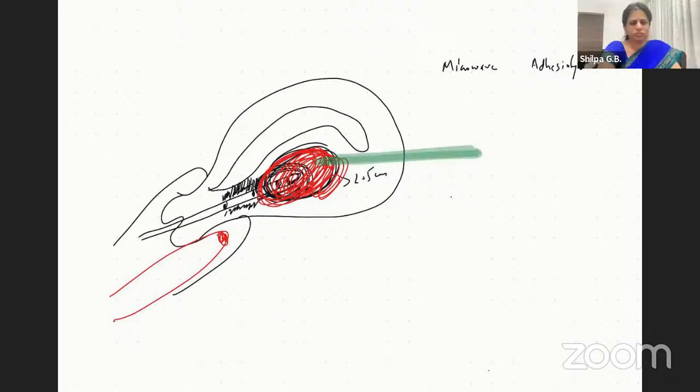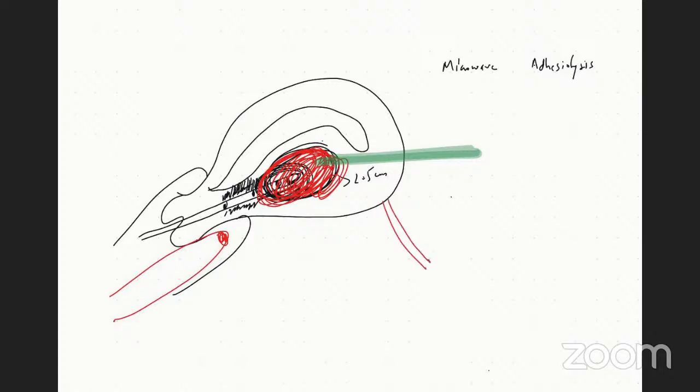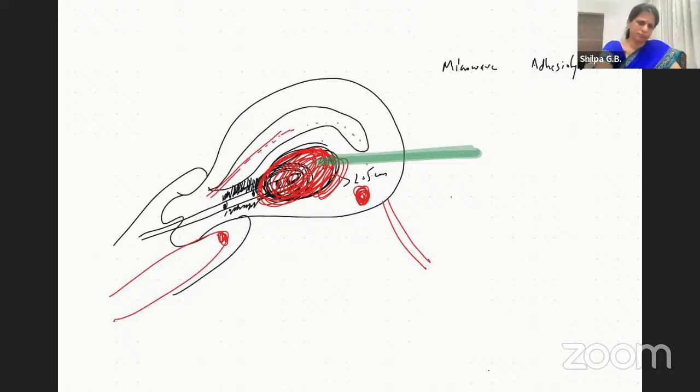So this clarity with our synchronization we have achieved very nicely. We are able to put ablation even in this region, close to the fallopian tube. For a small adenomyoma here, we will save the fallopian tube. In that situation, madam, we will 100% put water, because like HSG, we want to delineate that fallopian tube. Once we delineate the fallopian tube, our probe will go right beside that and we will ablate. So I am going to share outcomes. Let 2-3 of my patients reach 7-8 weeks. I am going to share outcomes with natural conception post microwave ablation.